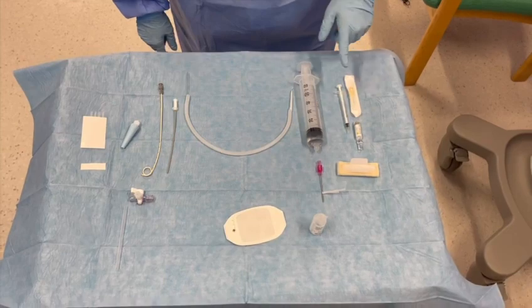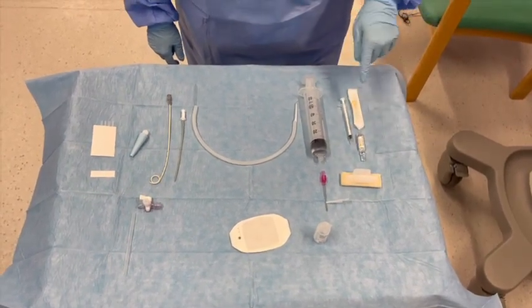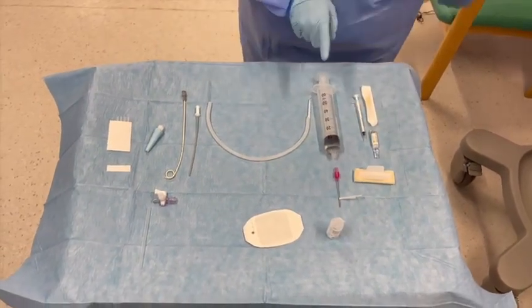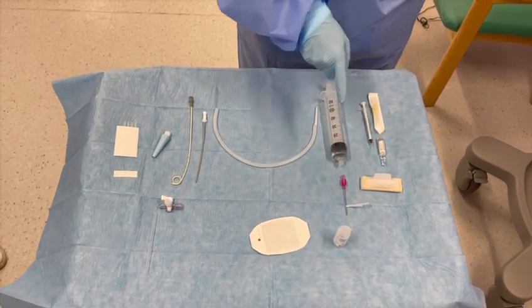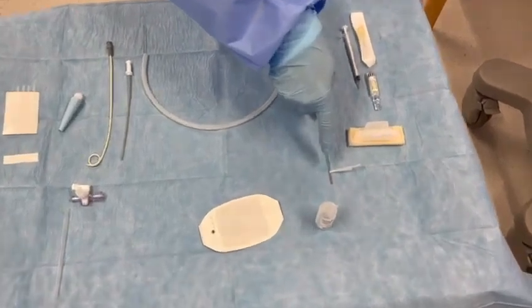Equipment required: 1 ml syringe to administer lidocaine, 0.3 ml per kilo. Chloroprep solution to clean the insertion site, 50 to 60 ml syringe for aspiration. Pre-marked insertion needle at 1 to 1.5 centimeters.